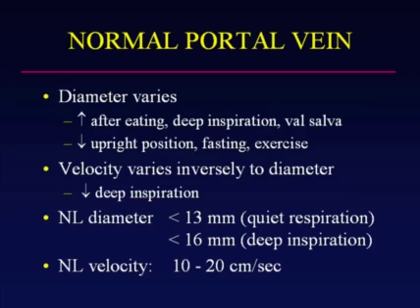As I mentioned already, the diameter of the portal vein will vary. It will increase after eating, with deep inspiration, or if the patient performs a Valsalva maneuver or coughs or sneezes. It will decrease if you scan the patient in the upright position, or after fasting, or following exercise. And as we know from all Doppler imaging, the velocity within a vessel varies inversely to the diameter. So if the diameter of the portal vein increases following deep inspiration, the velocity will decrease.